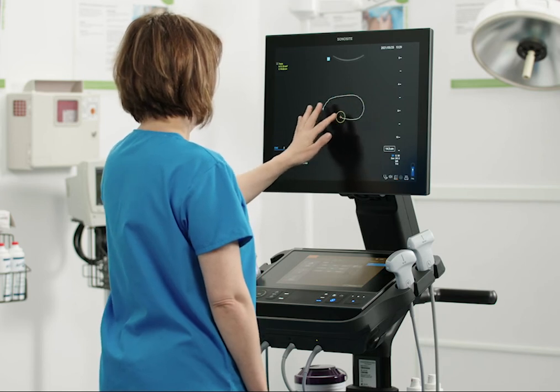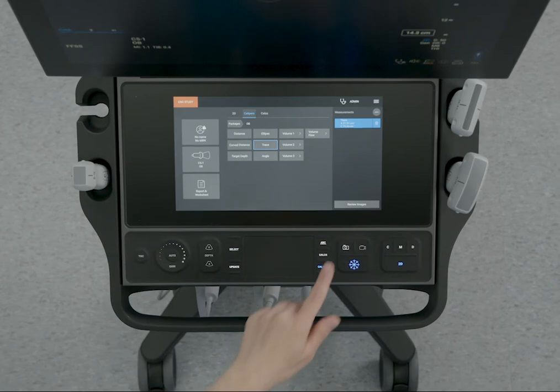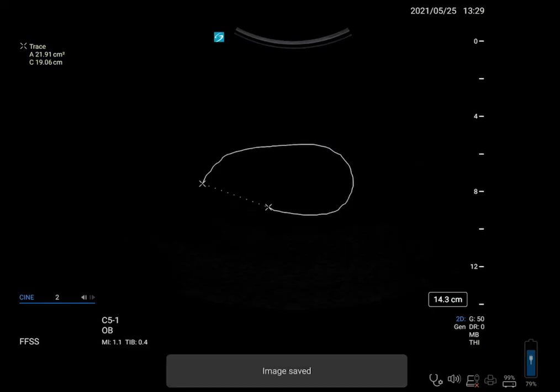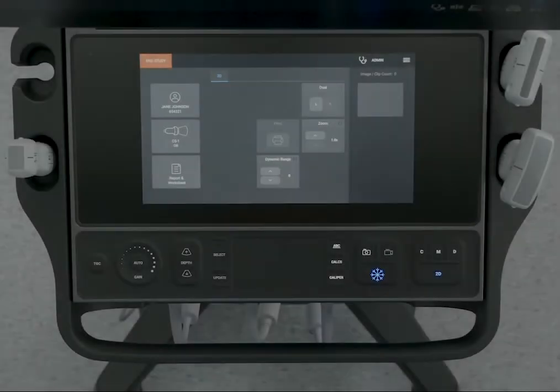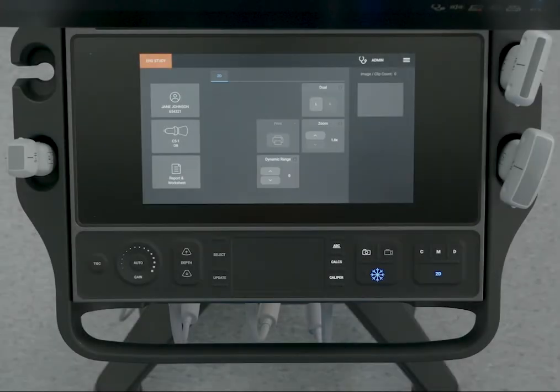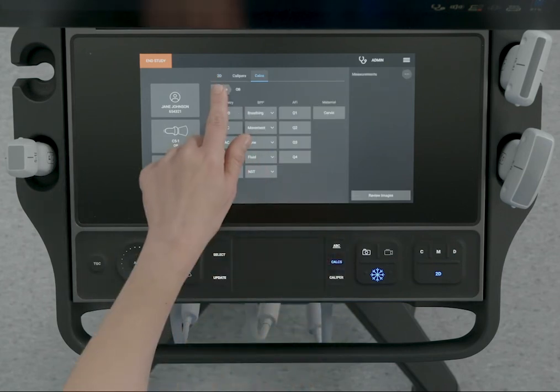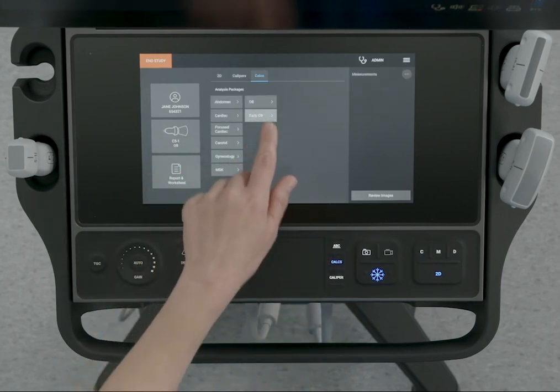Basic measurements appear on screen only and are not in a specific report page. Because of this, we recommend that you save the image with the measurements before ending the study. You can also save a measurement to a calculation or patient report. While measuring, press the calc control and select a calculation package, then the measurement you want.